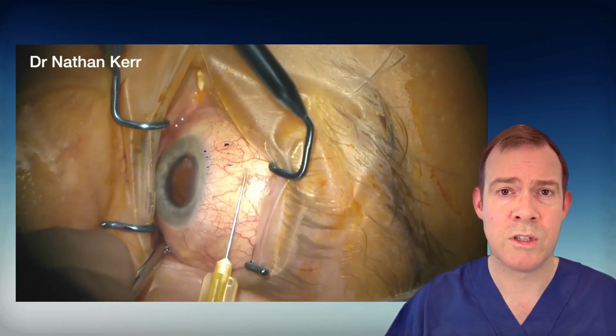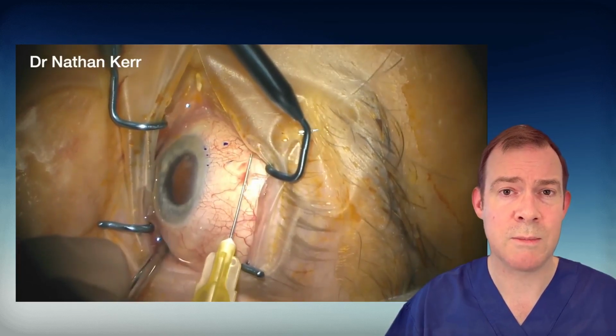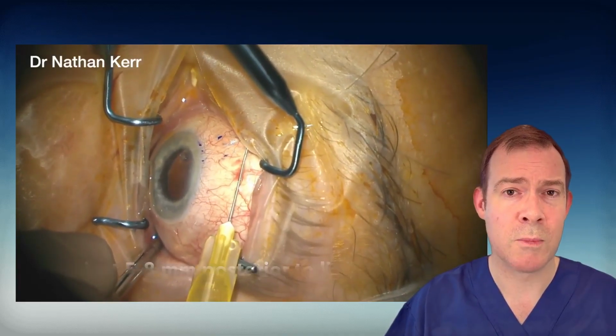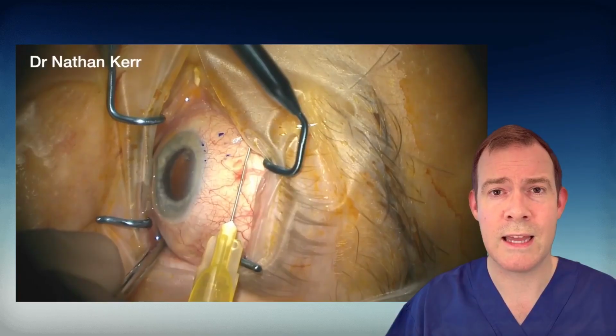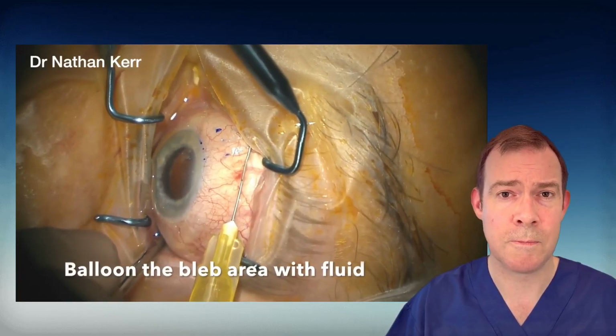There are various fluids that surgeons can use at this step. Some use off-label antimetabolite. My preference is to use filtered air followed by a cohesive viscoelastic at this point to make a space into which the XEN can be inserted.